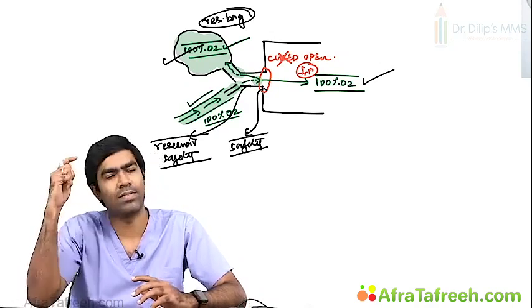So why are we having this many safety mechanisms? Suppose you have connected to the reservoir and due to some reason your gas flow has stopped. What will happen? Then how will the bag inflate now? Because now if you are connected to the reservoir and you have oxygen coming through the oxygen inlet, and due to some reason the oxygen flow has stopped because of technical or manual error, now when you are compressing and inflating the bag, the inlet valve will open, but there is no gas flowing into the reservoir nor coming from the oxygen nipple also. So this is a deadly scenario. The bag will not inflate at all, then the patient will not get ventilated and you are in a soup.